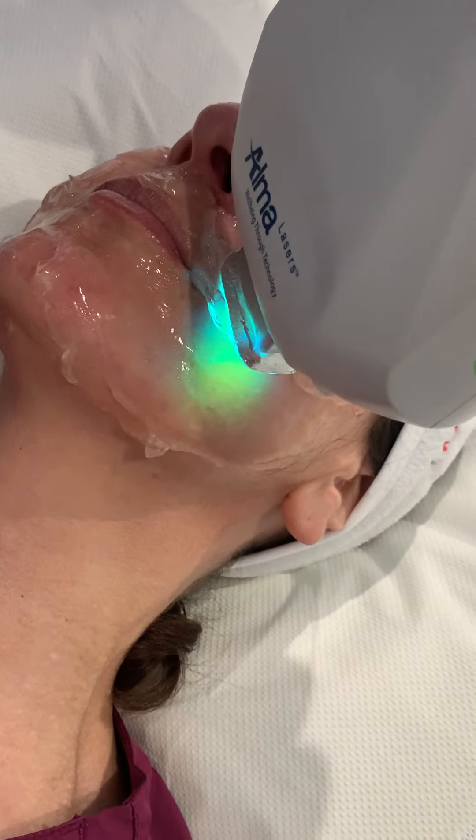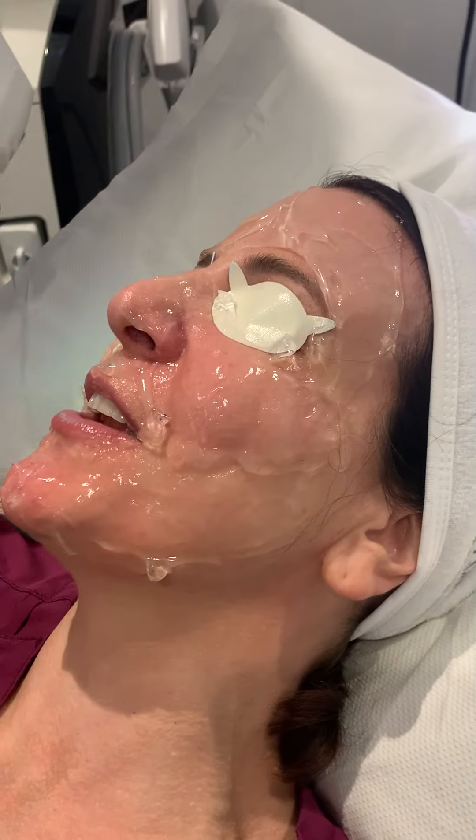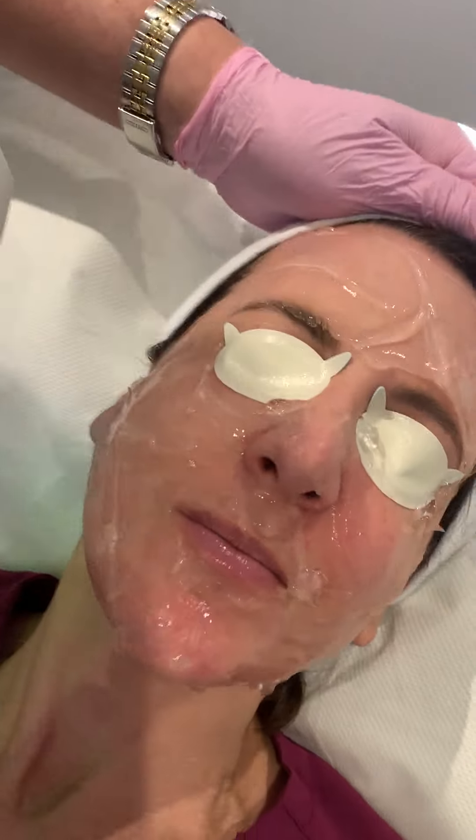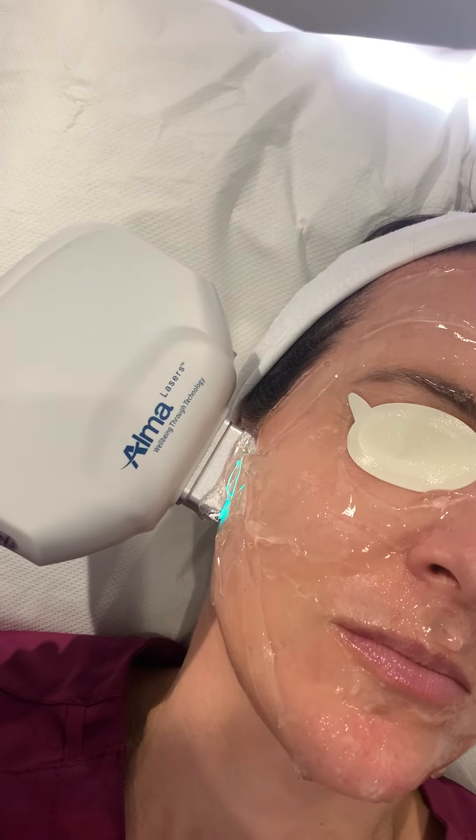It's quite a stingy treatment, although you wouldn't believe it watching that. But it can just make you jump sometimes in the middle of your face, can't it. We'll just turn it that way and do the same ones again, running around here.